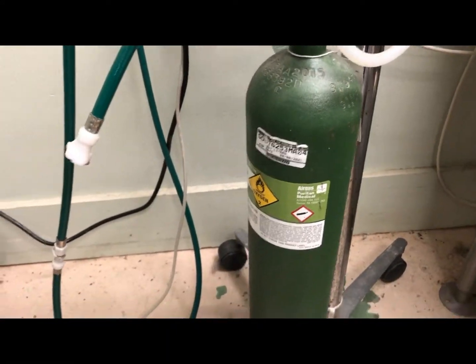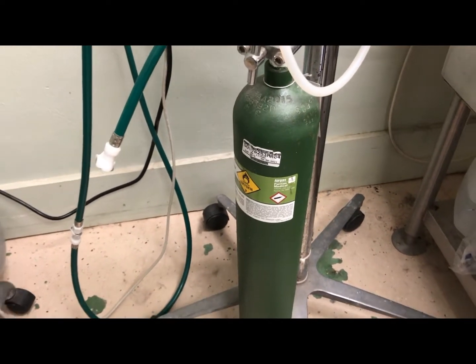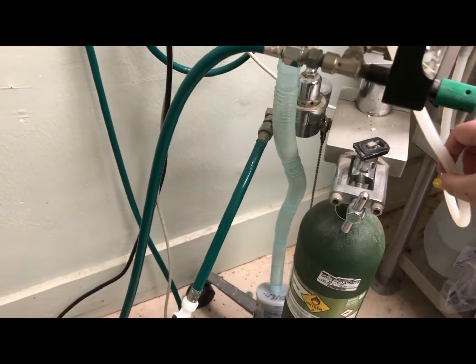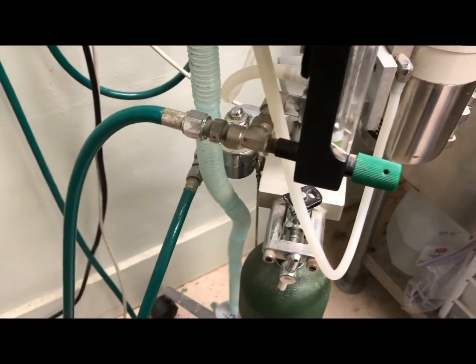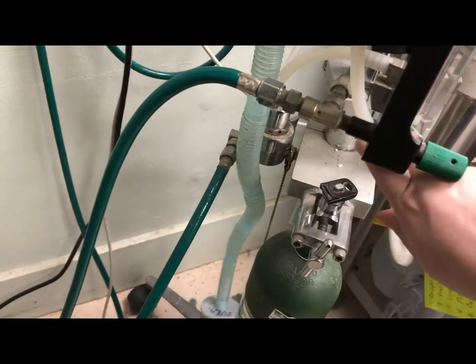Our oxygen first starts out in our tank. This right here is an E-tank, so it's a small one, and it's going to go through two separate spots before it actually gets into the system — the first of which is our pressure reduction valve over here.